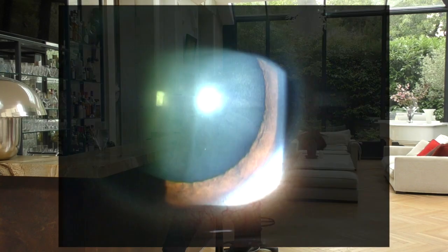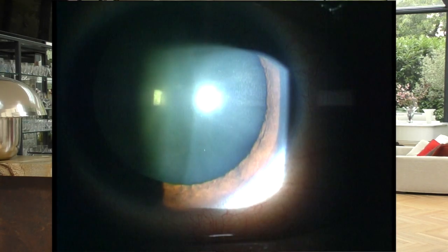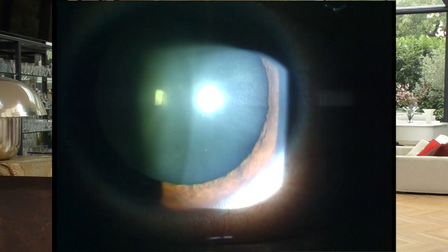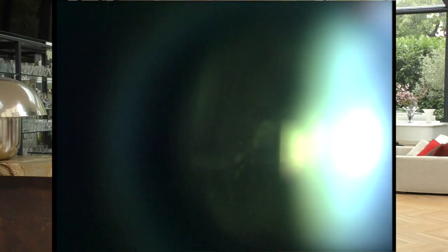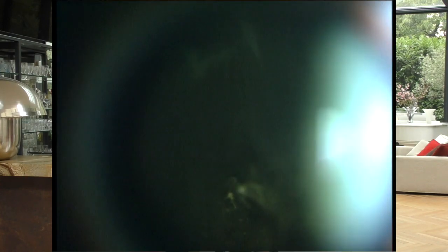Well, you ask your patient all the usual questions about functional sight and their age. Intraocular pressure was taken, as well as visual acuity. The patient has been dilated and is sitting here in front of you. The first thing you will notice is the quality of the pupil dilatation. A good dilatation is a very good prognosis. You will take this opportunity to defocus a little bit in the vitreous, because when the PVD is complete, you can see the posterior hyaloid and the vitreous moving during the movements of the eye.